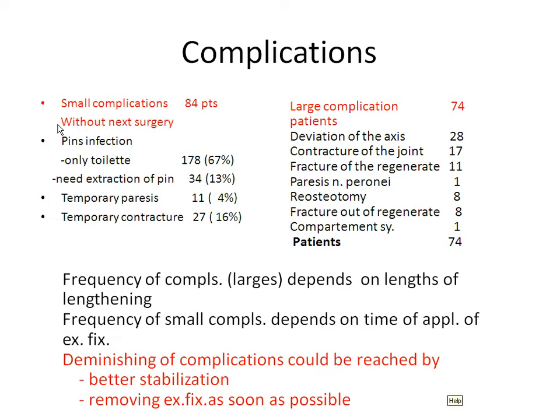You can see that toilet of pin infection means that we must make aggressive toilet, practically in all patients who are under lengthening with a pin fixator. We have seen from this statistics that the frequency of large complications depends on the length of lengthening, that means the interval which we need. The frequency of small complications depends on the time of application. So to diminish it, it's better to reach better stabilization and remove the external fixation as soon as possible.